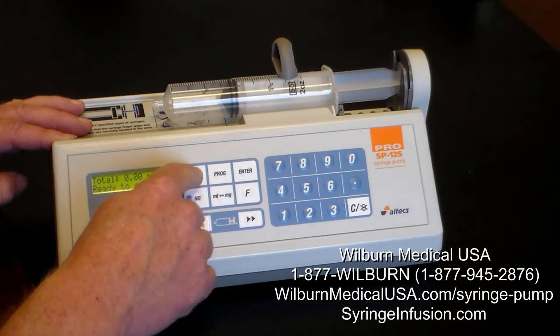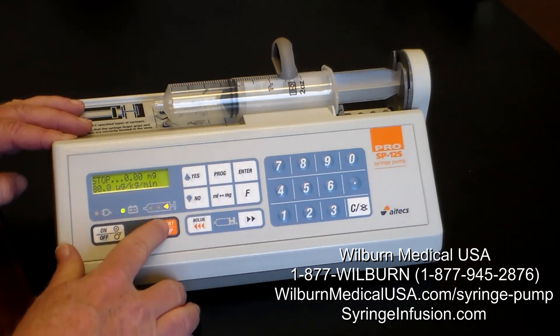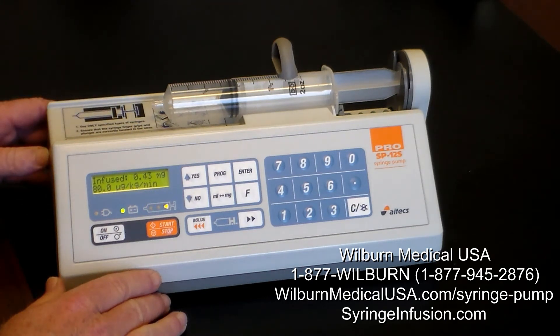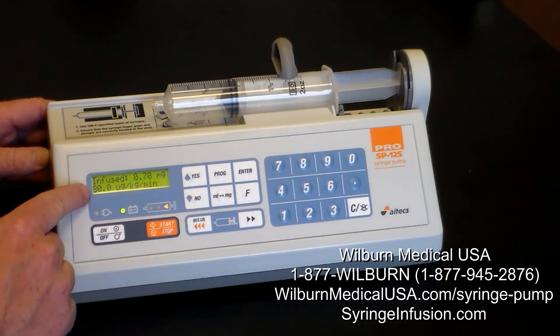Total ready to run — we press yes, and now we press start. It's going to pump away at 80 micrograms per kilogram per minute, as displayed on the pump.